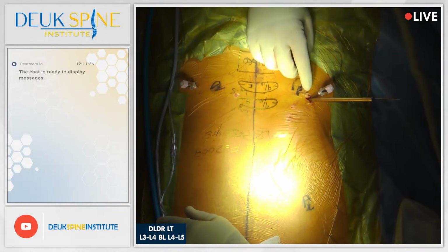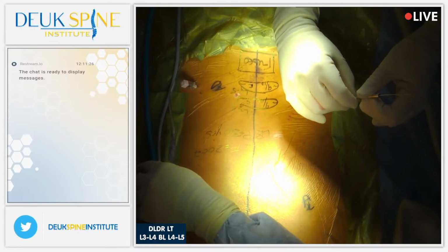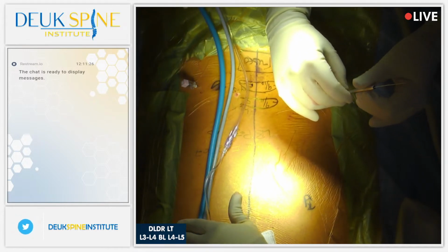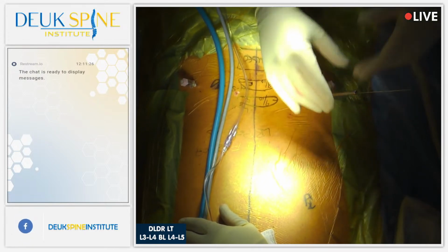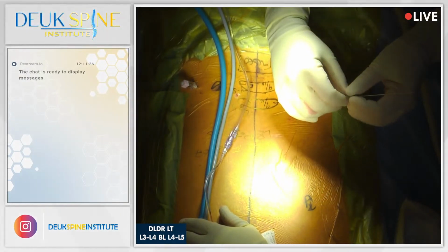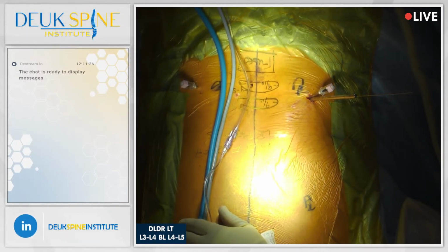All right. So he's asleep now, and we're going to advance the dilator. What he was complaining about there for a second was the dilator is touching something called the fascia. And the fascia is basically a connective tissue layer above the muscle. As it passes through, the fascia has nerve fibers in it, pain nerve fibers. And so people can feel anything going through the fascia, and that hurts.